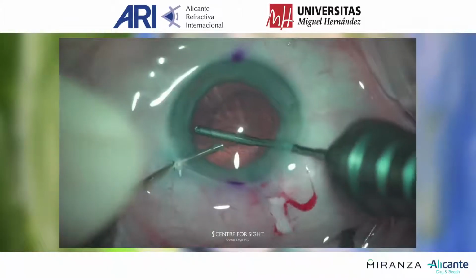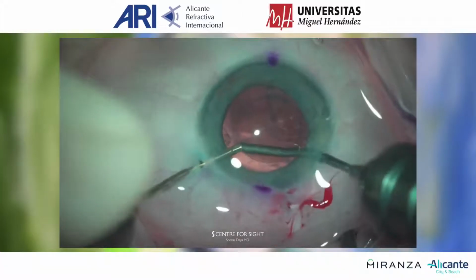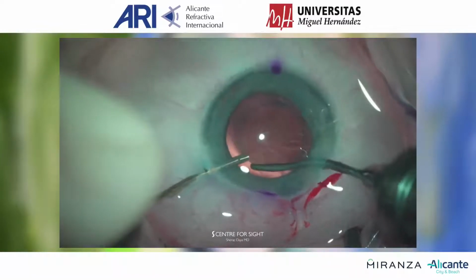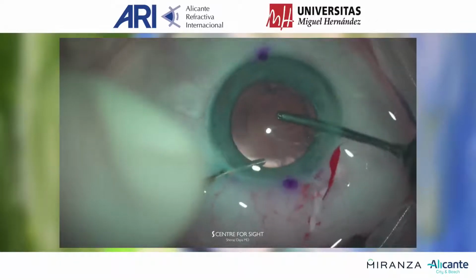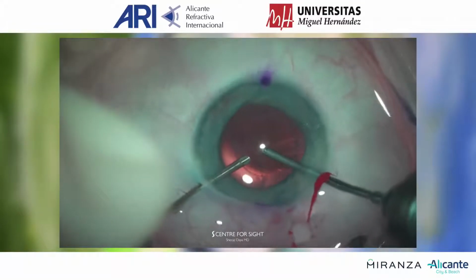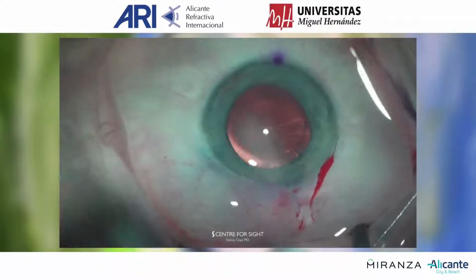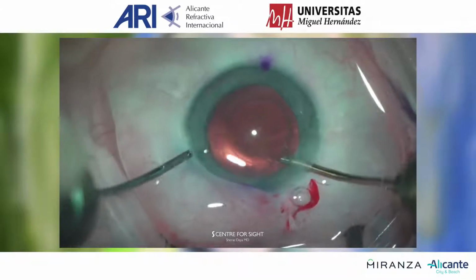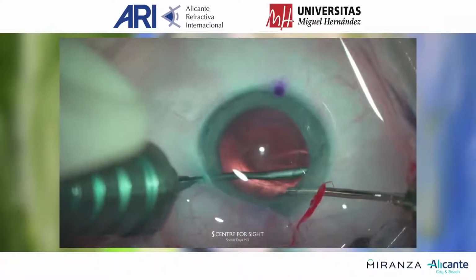Following lens removal, bimanual irrigation aspiration is performed. You can see the nice blue circle at the edge of the capsulotomy. This I find very useful in identifying where I am. The remaining cortex is now removed.